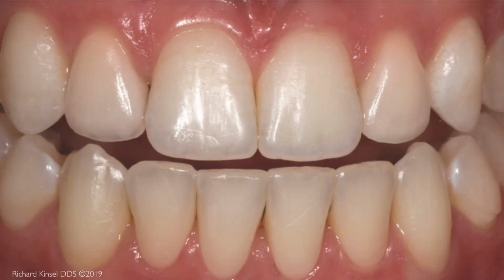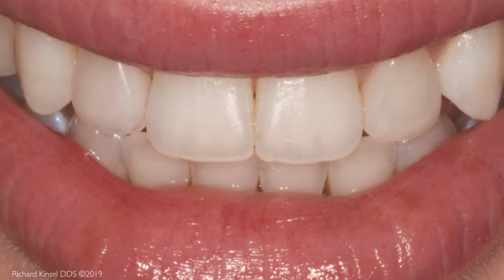The final result is 6 upper porcelain veneers and 4 lower veneers that close the spaces between the teeth and reproduce the proper width and length. In the smile view, the porcelain veneers duplicate healthy natural teeth, which improves her smile.